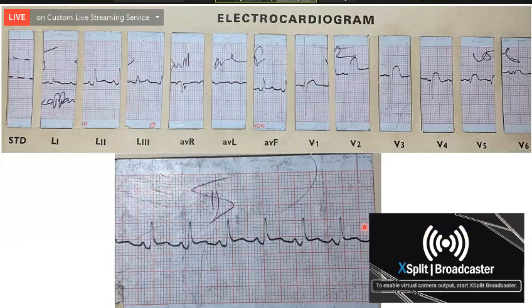Okay, what is this? Sir, normal sinus rhythm. Very good. ST coving in lead 1. Whenever there is ST coving in lead 1, what other lead should you quickly look for? Any coving? AVL, sir. So AVL also shows some degree of coving. I am unable to see, sir. Yes, there is some degree of coving. Yes, it's more pronounced in lead 1.